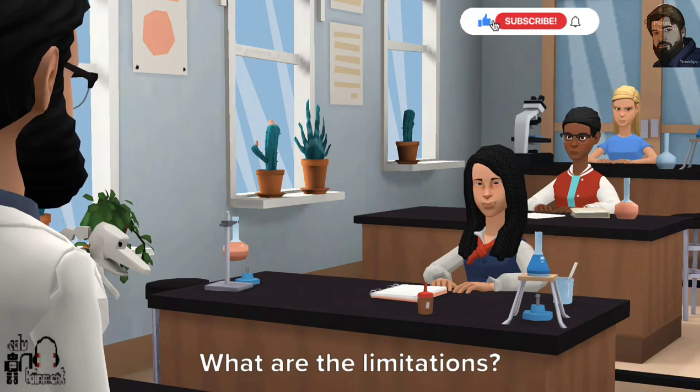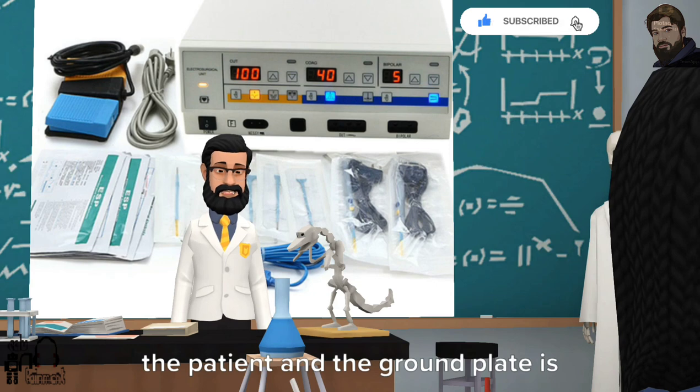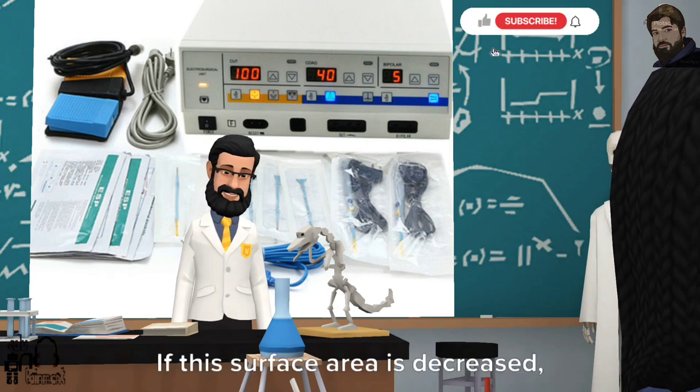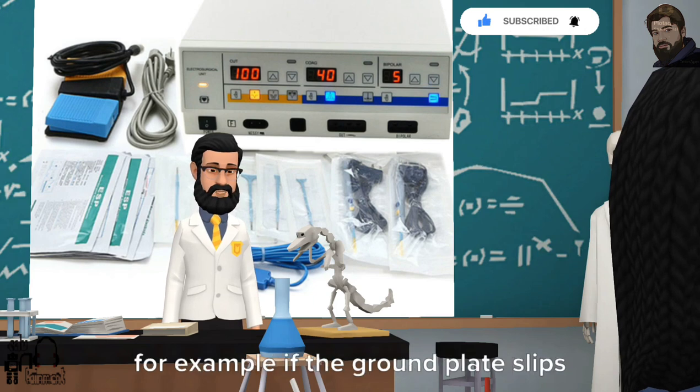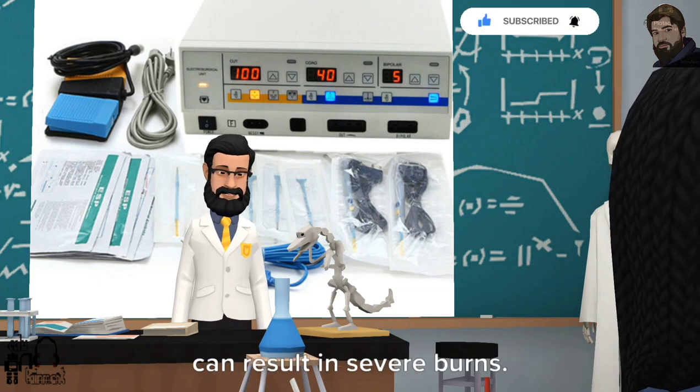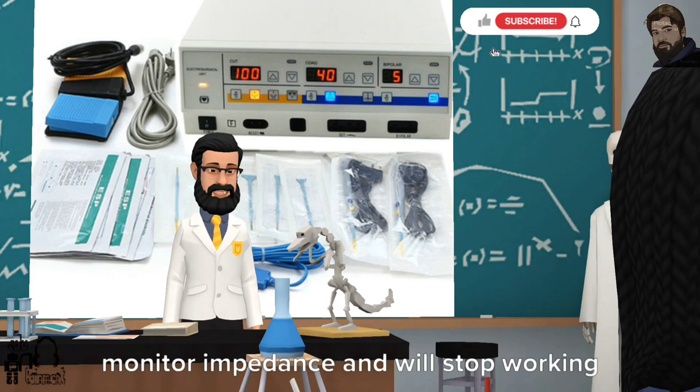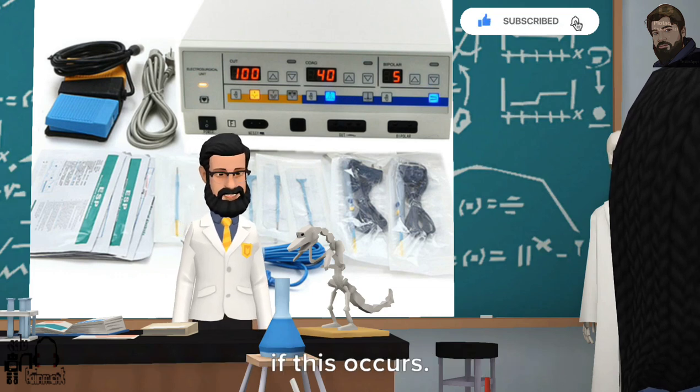What are the limitations? In monopolar mode, good contact between the patient and the ground plate is essential. If this surface area is decreased, for example if the ground plate slips partially off the patient, then this can result in severe burns. Fortunately, many modern machines monitor impedance and will stop working if this occurs.